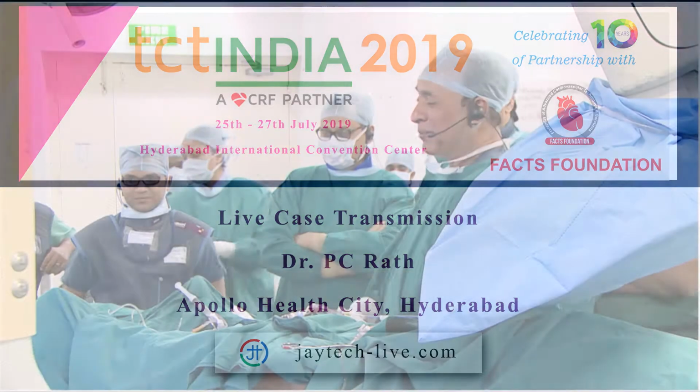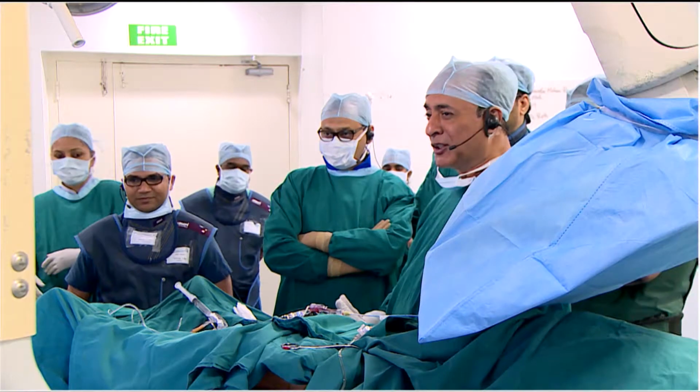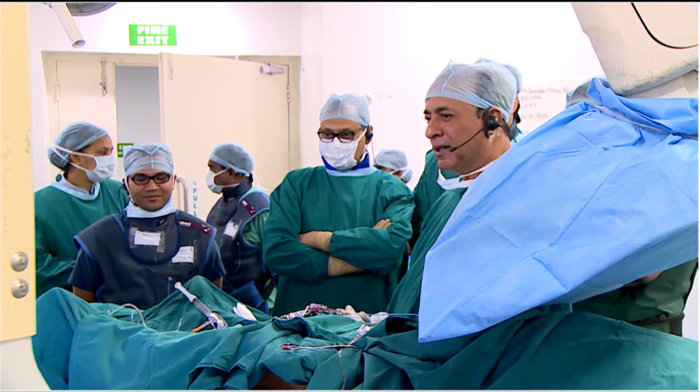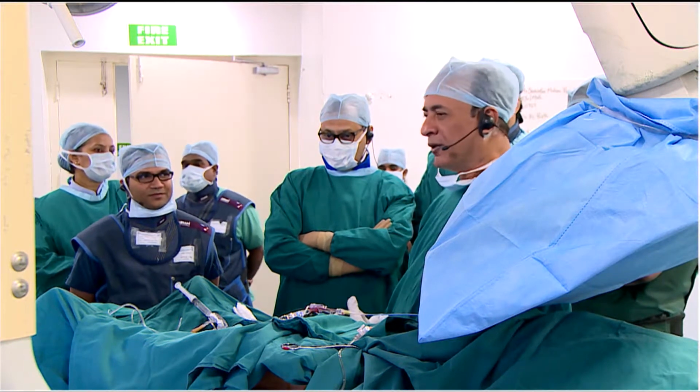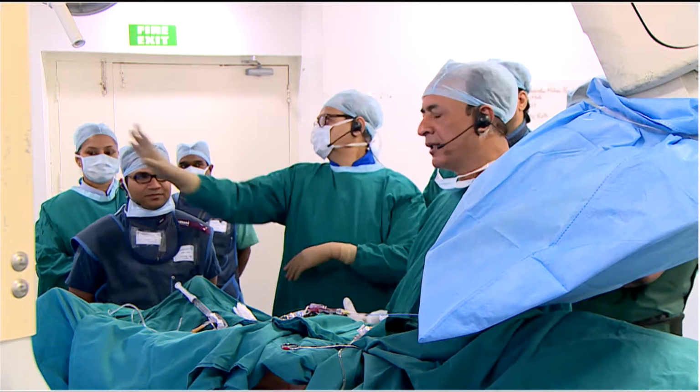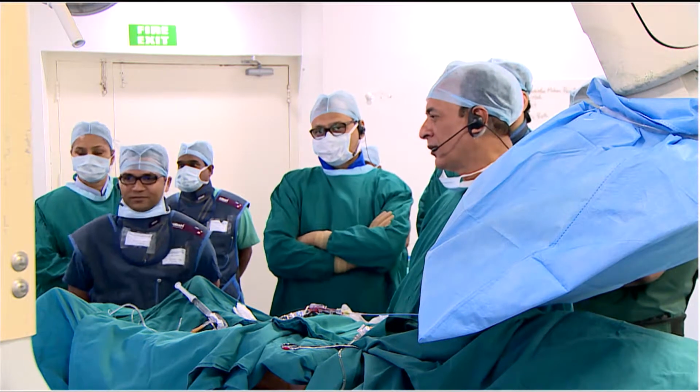Thank you very much and welcome to TCT India, with greetings from Apollo Hospital, Hyderabad. We have a very interesting case for you, a very critical left main bifurcation case with an additional lesion in the LAD and a totally occluded RCA.